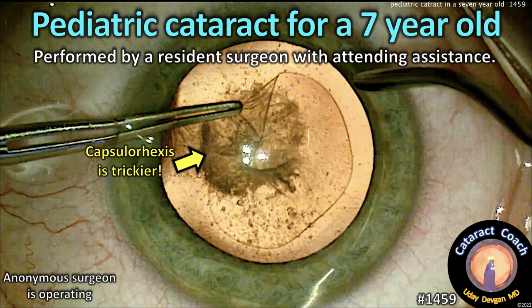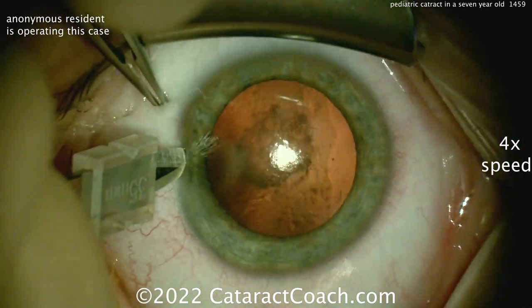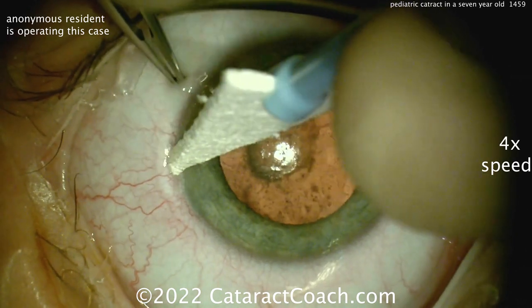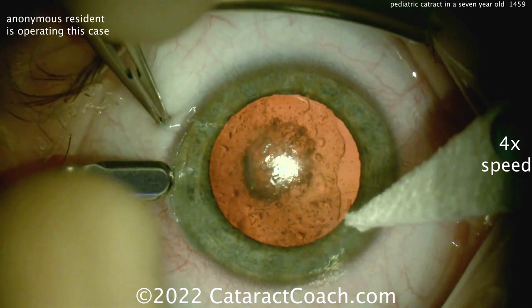CataractCoach.com — a pediatric cataract in a 7-year-old patient. This is performed by an anonymous resident surgeon with attending assistance. Here's the case, and you can see this is a very posterior-looking cataract in this young patient. This is certainly very visually significant.